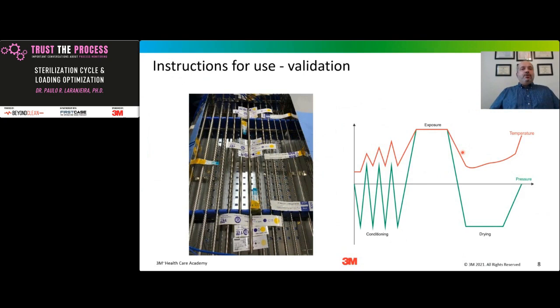They have to use the same parameters. They cannot have specific parameters. We are seeing some extended exposure times. There is a lot of discussion on that. I'm not going to go in there in this presentation.